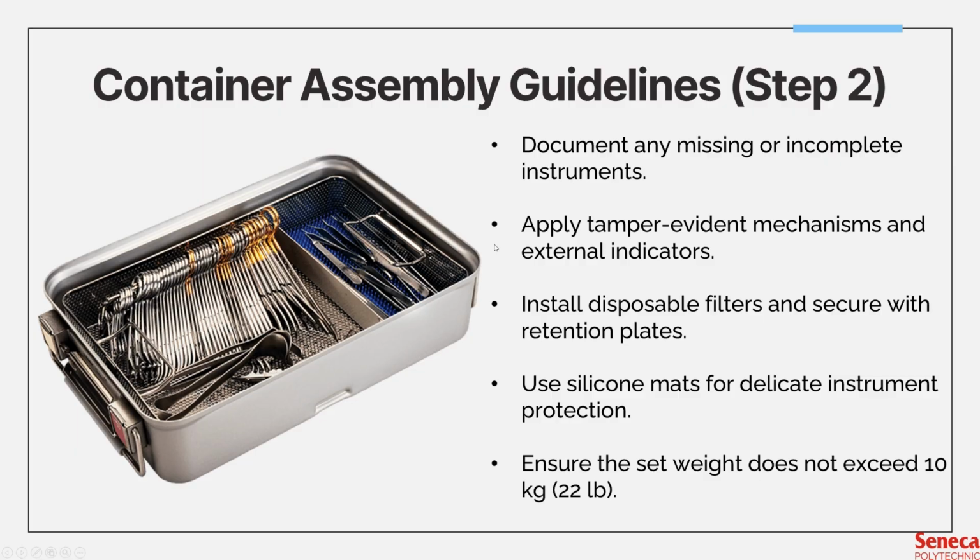And most importantly, you have to ensure that the total set weight does not exceed 10 kilograms or 22 pounds. But I think I've said a story before where a lot of hospitals actually do not follow this guideline regarding weight, especially for the really heavy instrument sets, more specifically orthopedic sets.